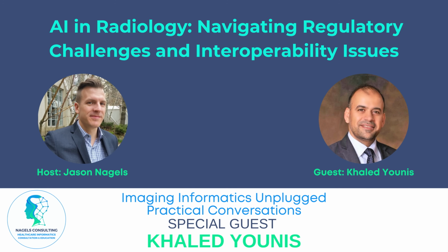What went wrong with the early CAD, I think, is that it used to highlight masses and tried to actually diagnose, to find if there's a real mass, malignant versus benign, and the technology was not ready for that. We used to have traditional machine learning, which depends on getting the features extracted after a lot of stages of image processing, because we had film at that time and we needed a digitizer.